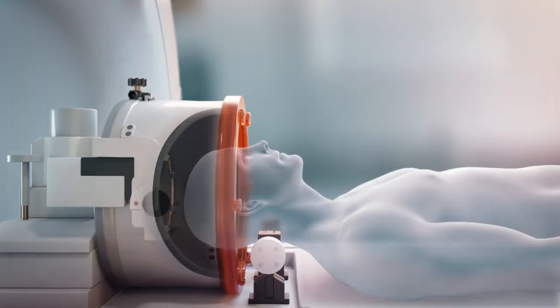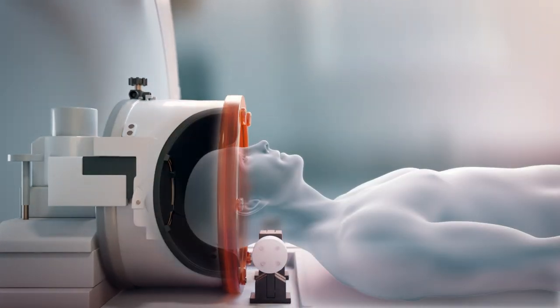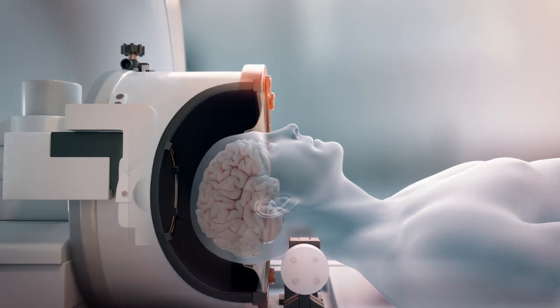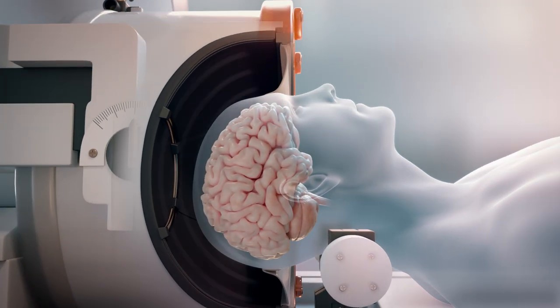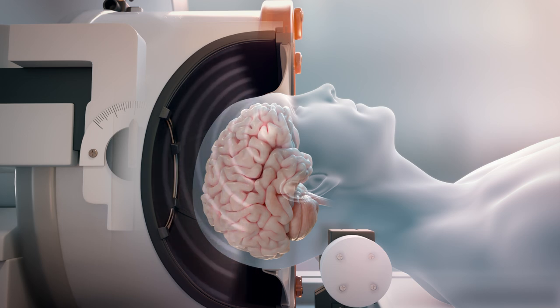The ultrasound waves are generated by a transducer array fitted around the patient's head. With guidance from MRI, the transducers can be targeted to sonicate precise brain regions of interest.